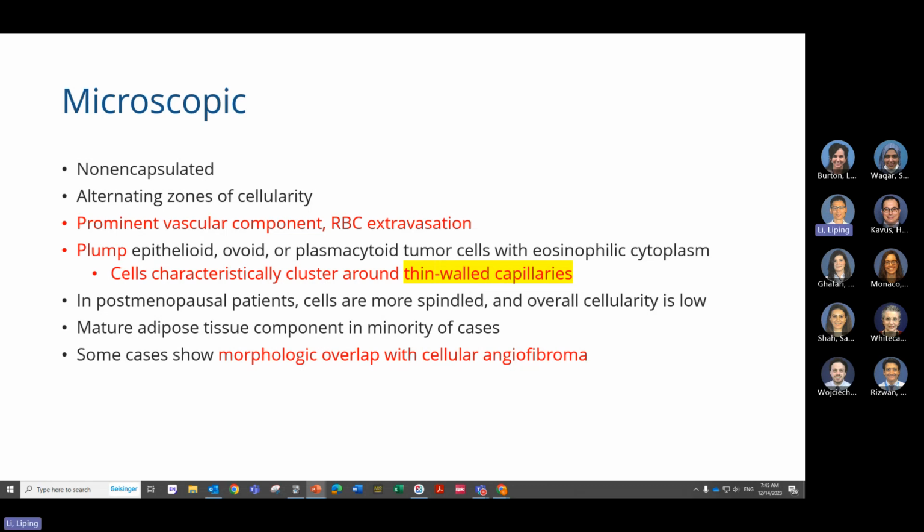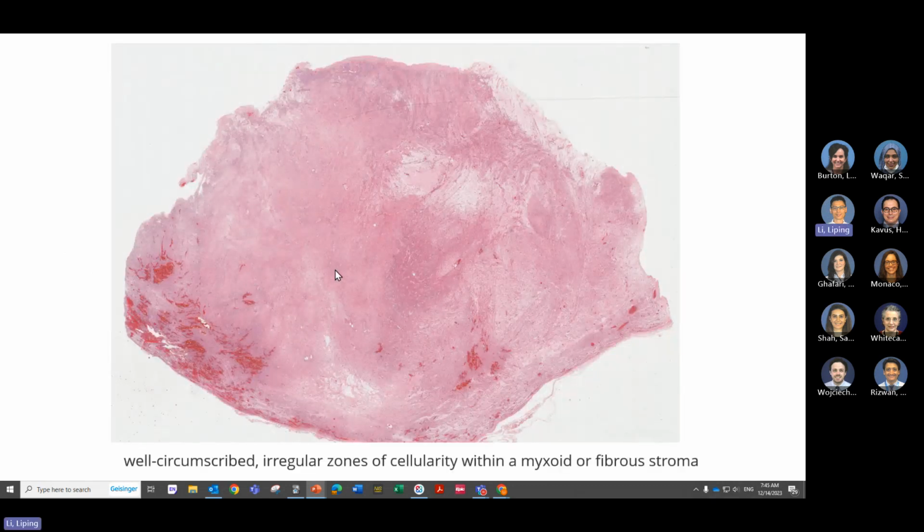And then for this one, the myoid bundle, that means the smooth muscle cells kind of forming this fascicle, will be really prominent compared to other entities, even the first one we mentioned, deep angiomyxoma. So you can see we have hypocellular area and also hypercellular area. And even in this low power, you can see this fascicular growth, smooth muscle forming really long myoid bundle for this entity.